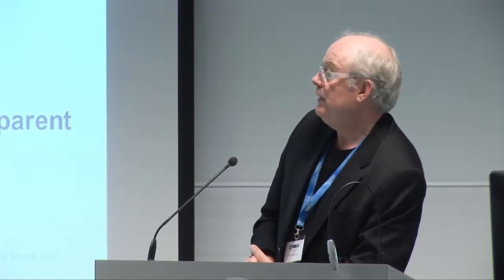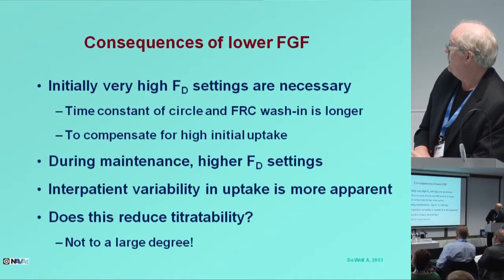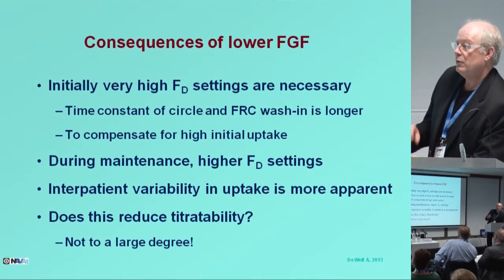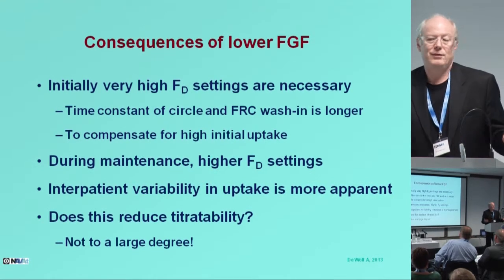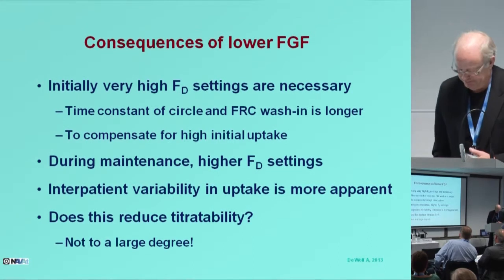During maintenance, you still need higher FD settings to compensate for patient uptake. But interpatient variability in uptake becomes more apparent when you lower fresh gas flow. I'm going to show that in one of the next slides. And people ask, well, does this reduce titratability? Well, not to a large degree, because we can measure what we're doing. We can measure FA, therefore it's pretty easy to just dial to get the desired effect.